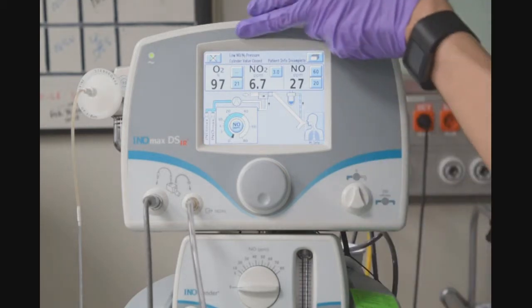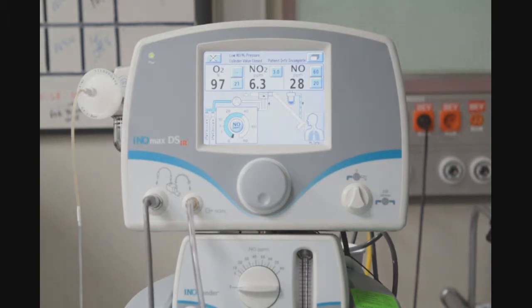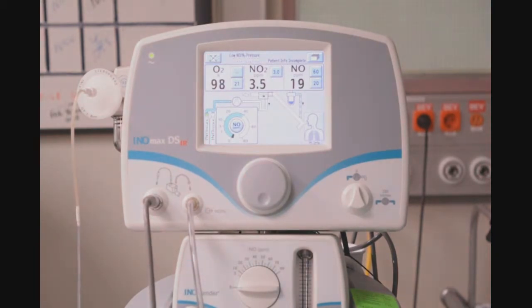At this point you can see that we achieved that alarm: low NO and N2 pressure. Next, I will open the cylinder valve and I will turn the INLMAX dose to zero.